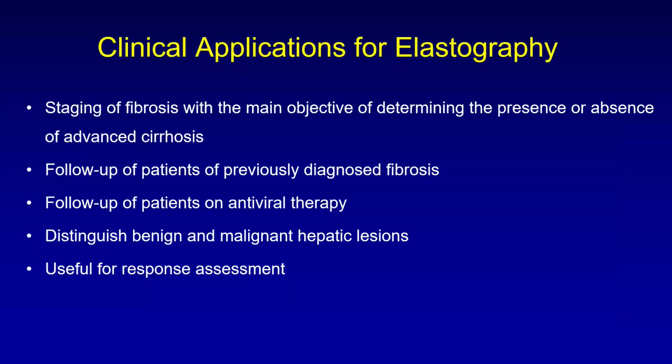The clinical applications for elastography are: staging of fibrosis, with the main objective of determining the presence or absence of advanced cirrhosis; follow-up of patients with previously diagnosed fibrosis; follow-up of patients on antiviral therapy; distinguishing benign and malignant hepatic lesions; and response assessment for chemotherapy and loco-regional therapy.